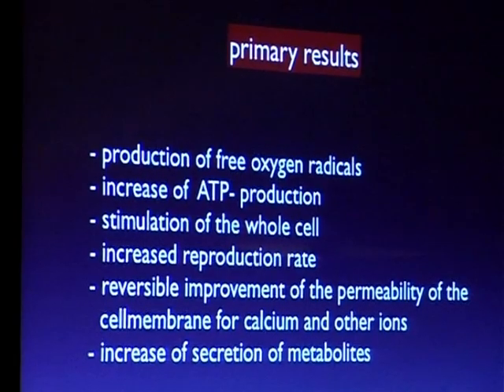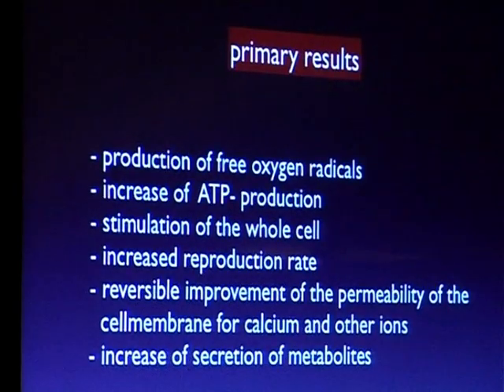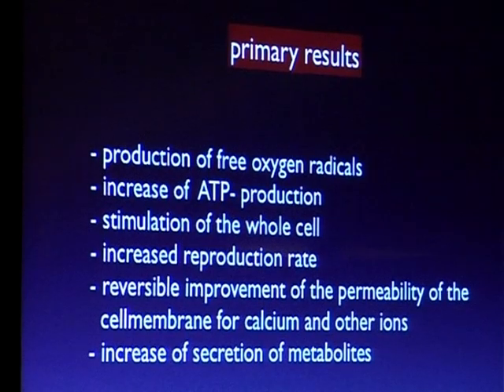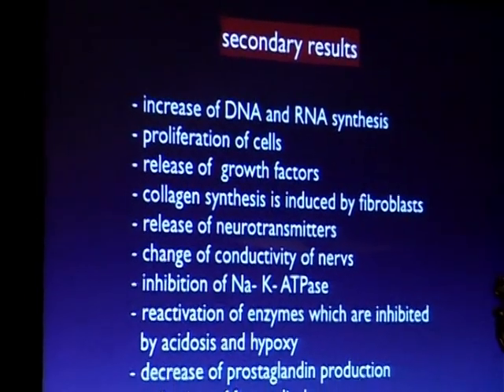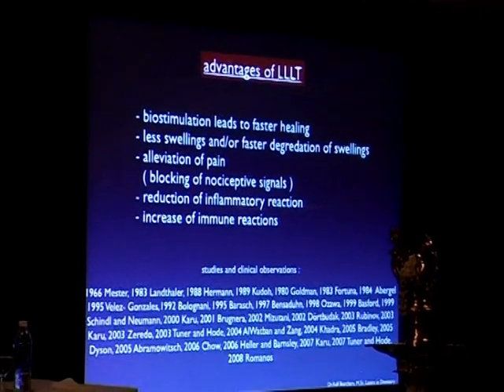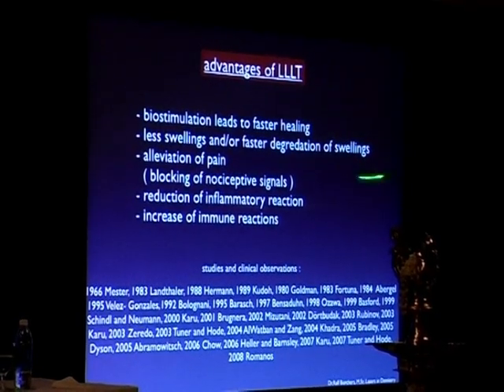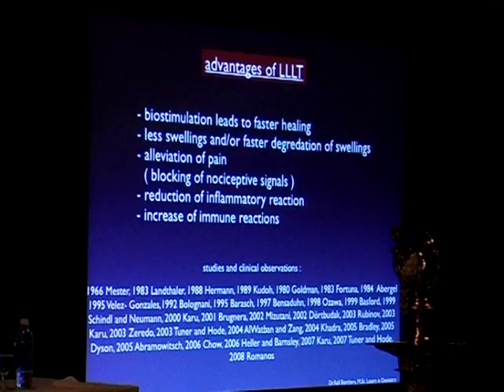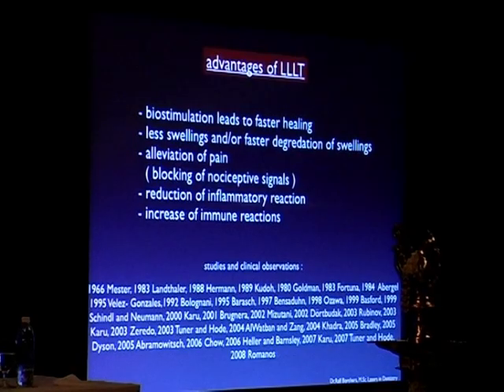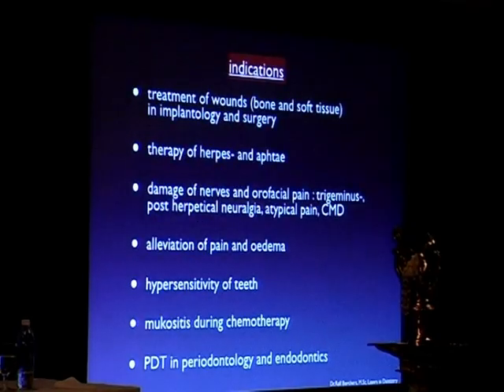There will be a much shorter recreation time. The healing process is increased, and all activities are much better than without low-level laser therapy. The advantages of the low-level laser therapy are you have a biostimulation. It leads to faster healing, better healing, less swellings, faster degradation of swellings, alleviation of pain. You are blocking the nociceptive signals, a reduction of inflammatory reaction, and an increase of immune reactions.